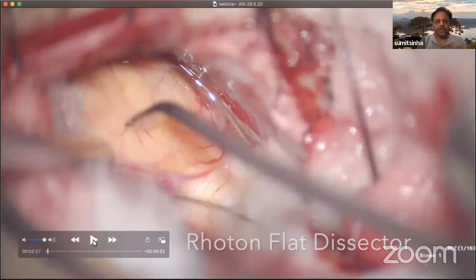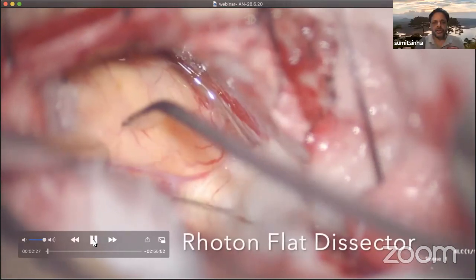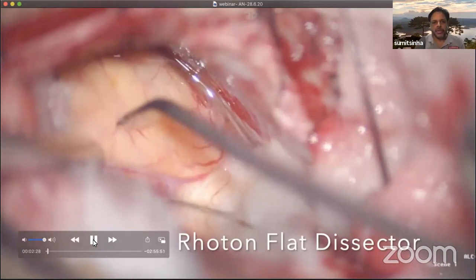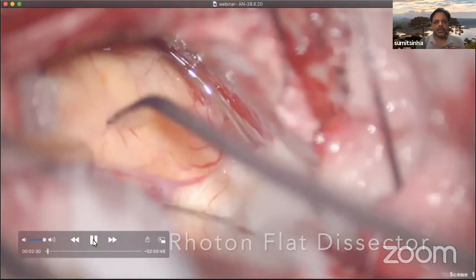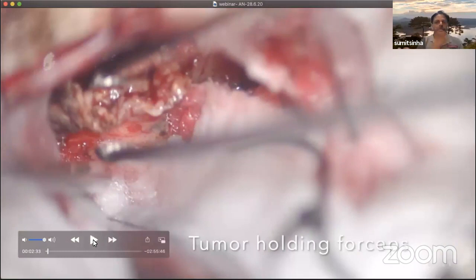The second dictum of the surgery is, there are certain instruments which are particularly helpful in doing this surgery. And I do this surgery by means of two instruments only. Every tumor has its own philosophy of dealing with, as you all might agree. For this tumor, the two most important instruments are a flat dissector, and the second instrument is a tumor holding forceps. And these two instruments can completely accomplish your wonderful surgery. You do not need any third instrument for doing this type of tumor.